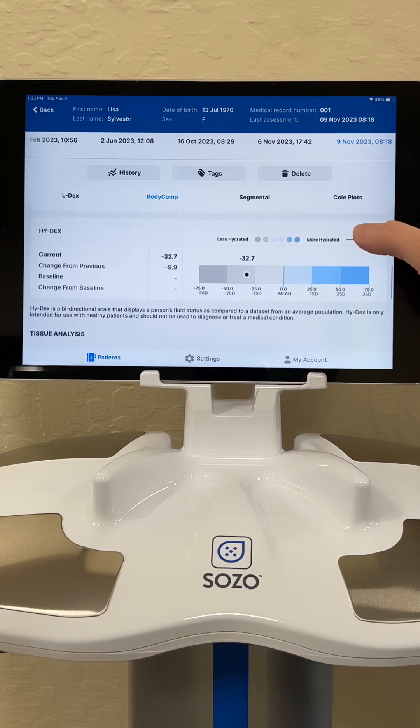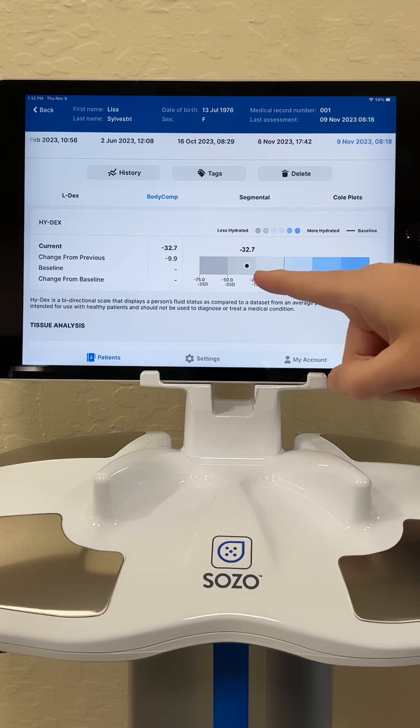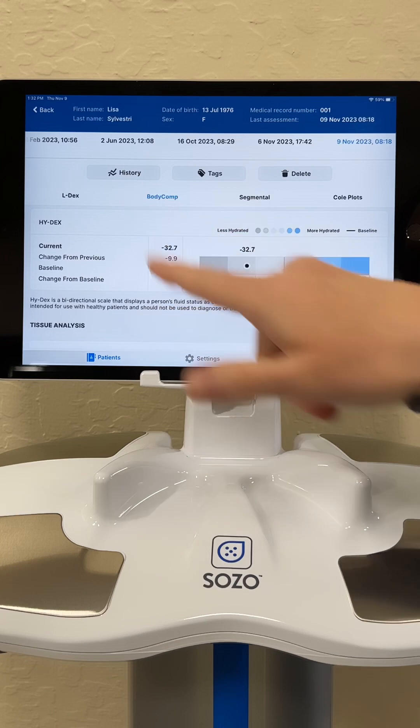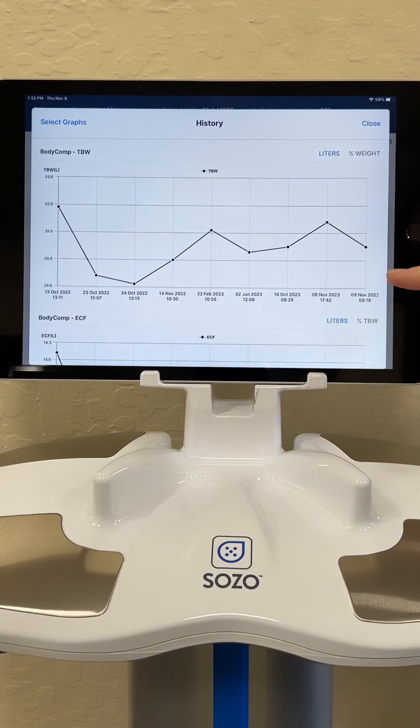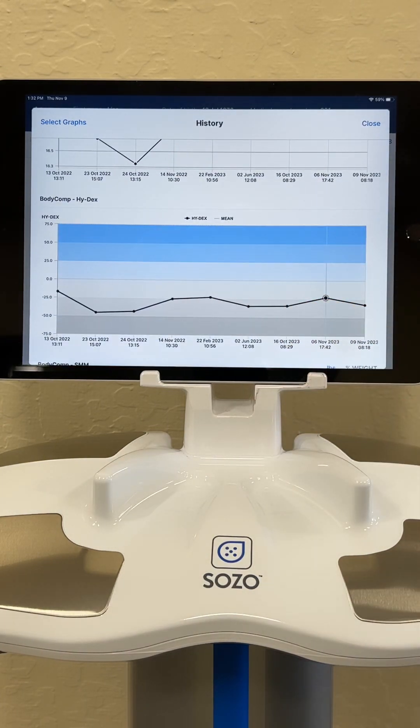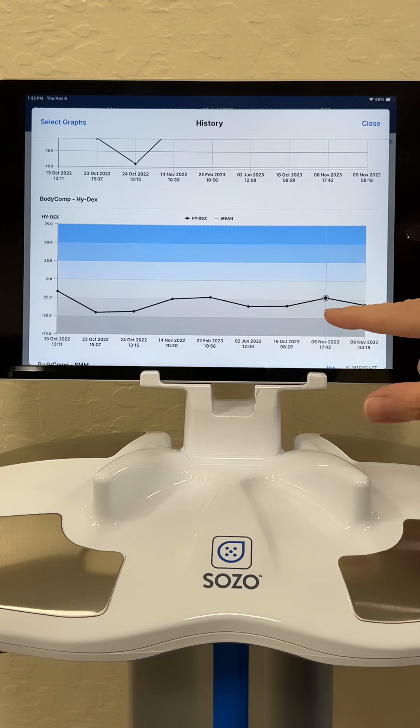As we go further down, we look at hydration levels. And oh boy, do I need to drink some water — I'm quite dehydrated at the moment. If you look at my history, we can look at all of these over time. We can see that my hydration levels tend to live in that dehydrated state, which is not great, but I'm working on that.